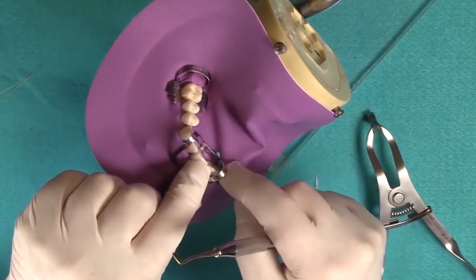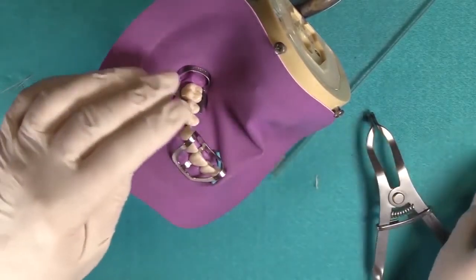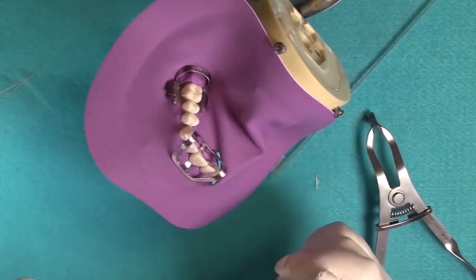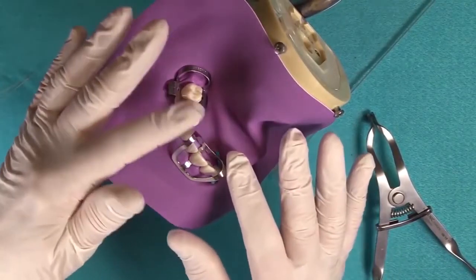So it encompasses both sides. Same thing over here. And that's what it does. You use the air syringe to cool it, and then when it solidifies, it'll stabilize this.